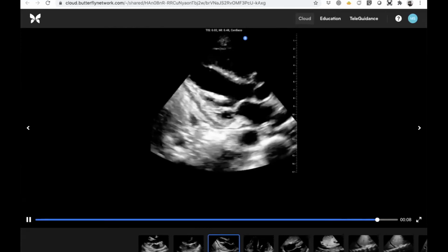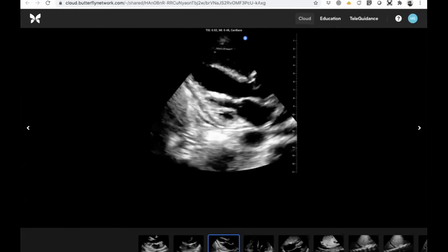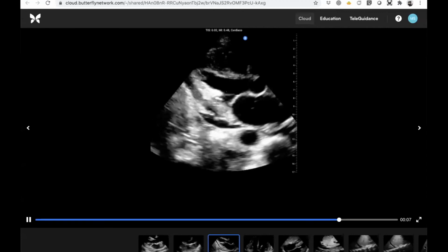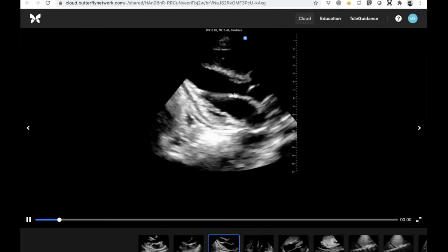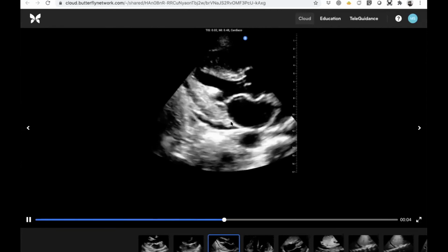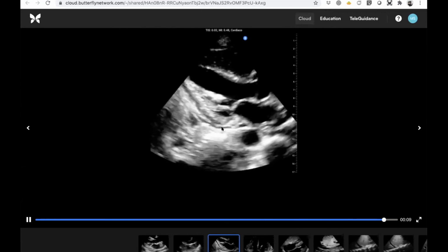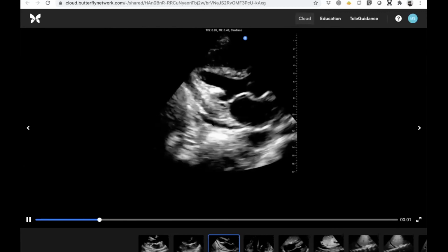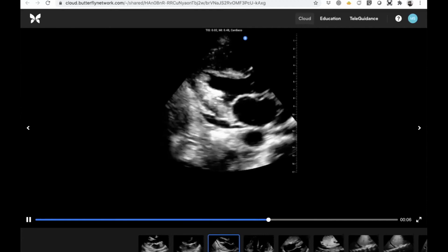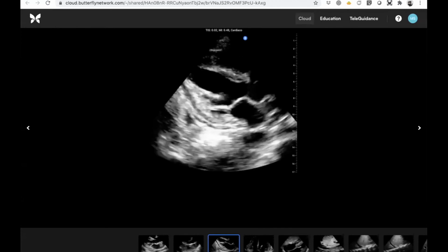Yeah, so first off, I'm guessing I have a little bit of lag with the beating, but I notice first there is a small, probably not terribly significant pericardial effusion here. And then if I'm looking at the left ventricle, I don't know if this patient might have a little bit of arrhythmia or not.